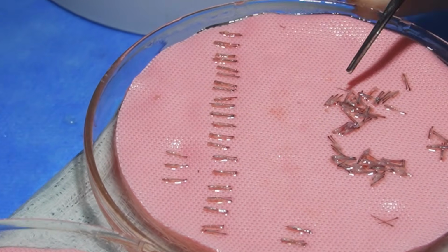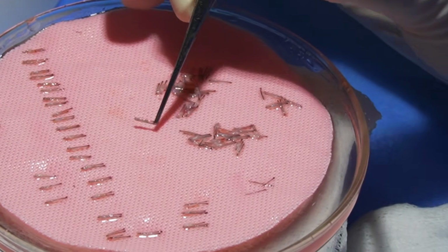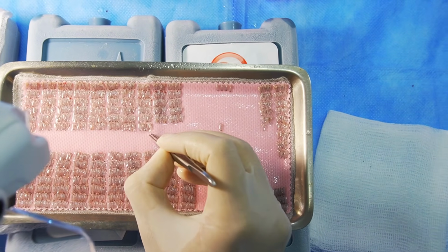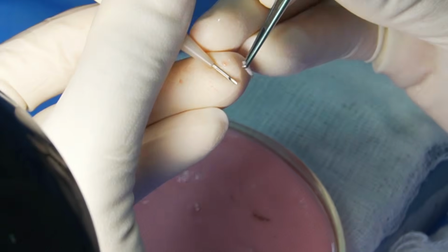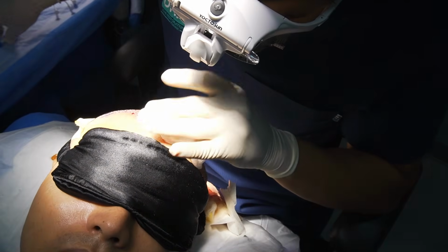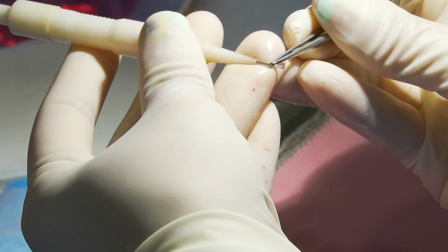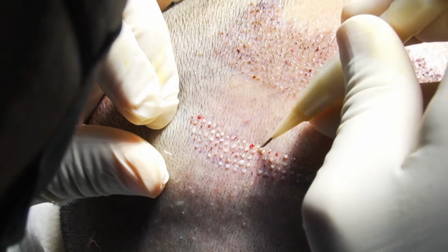While waiting to be implanted, the follicles are stored in hypothermosol, a specialized preservation solution designed to help maintain cells and tissues under suitable conditions while they remain outside the body. The proper extraction, handling, preservation, and prompt implantation of each follicle are essential factors for its survival. According to protocols and data reported by DHI Global, graft survival rates can reach up to 97%. Step 6. Loading the DHI Implanter. We now reach one of the stages that truly sets the DHI technique apart. Each follicular unit is carefully loaded into the DHI Implanter. The instrument is then ready for the physician to perform the implantation directly. This is where precision and planning come together.